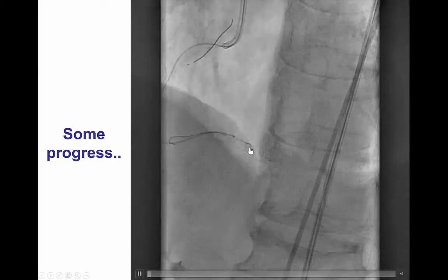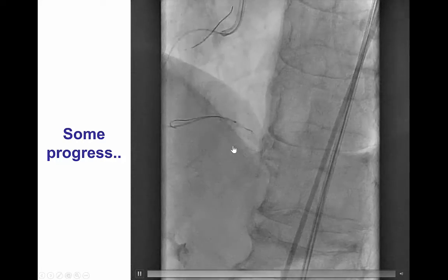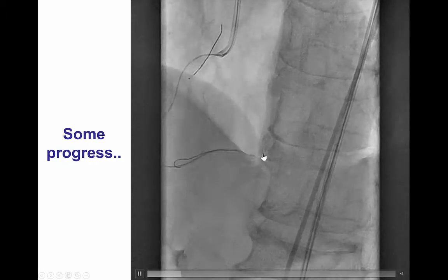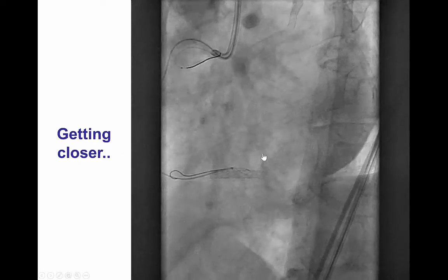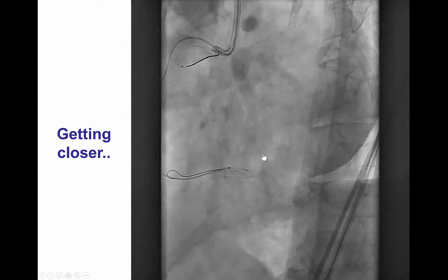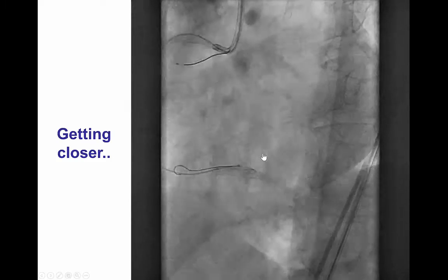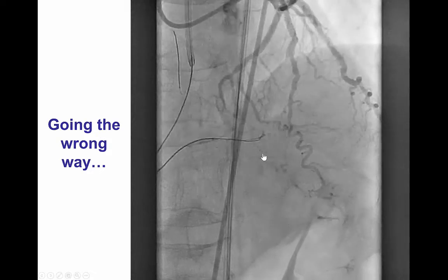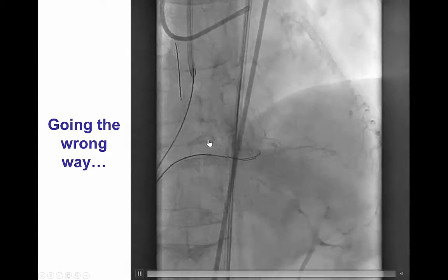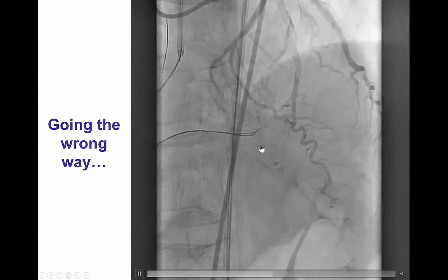You can see now the CrossBoss is advanced halfway through the previously occluded stent, and the knuckle is still moving forward. Slowly but surely, we were able to make progress moving around the previously placed stent, and finally we were able to advance the knuckle past the stent.